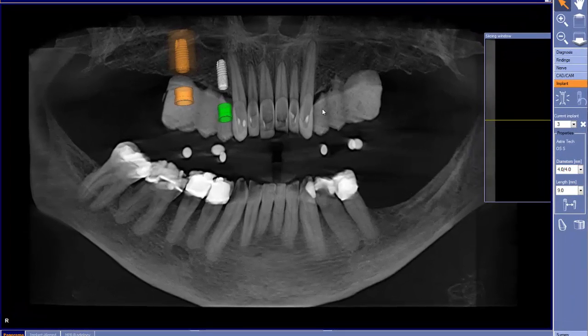All right, we have a wonderful case here to take a look at, and where I would like to begin is a good review of some basic surgical guide lessons here. So when I look at this case, the first thing that I notice is that we have radiographic markers in here, and that would be these right here. This immediately tells me that our intention is to use a CCAT classic guide.